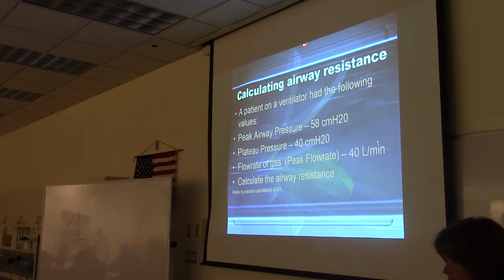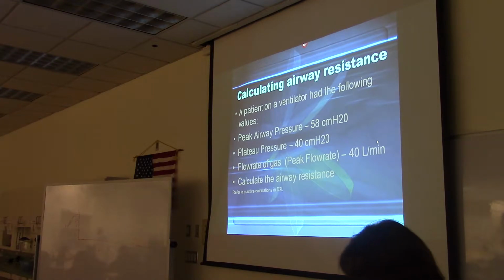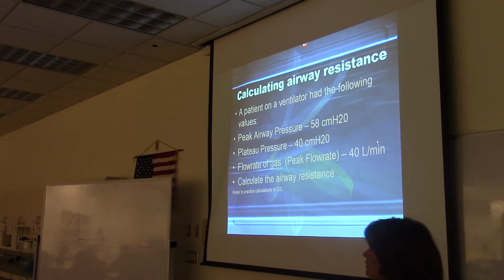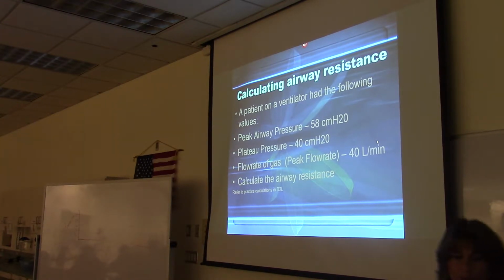You got 27? Like 45. 27. It was 18 over 40, right? 27. Yeah. And then you multiply by 60? Yeah. 27 centimeters of water per liter per second. Excellent, very good.